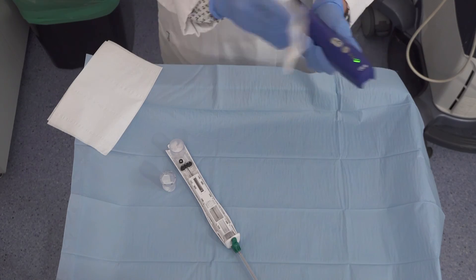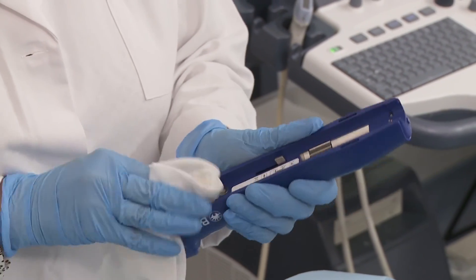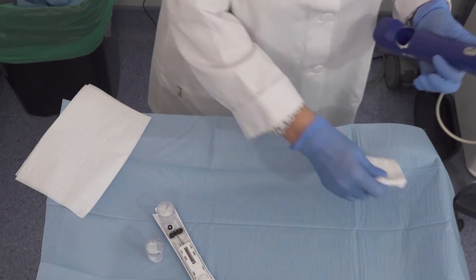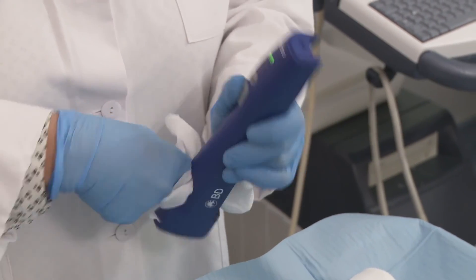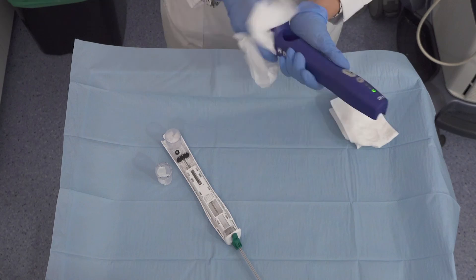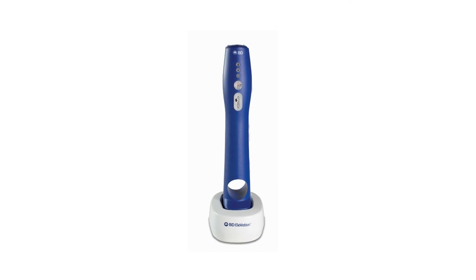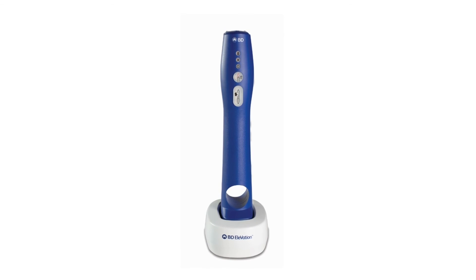After each use, wipe the BD Elevation driver with a validated product or cloth dampened with water to remove any excess blood or fluids present on the device. Pay particular attention to the buttons and indicators, locking tab, LED lights, internal gears, sample container slot, and sides of the driver. The driver must be dry before placing in the wireless charging stand. The probe, support cannula, sample container, and any other BD Elevation accessory are for single use only. After each use, the BD Elevation driver should remain in the charging stand, likewise when not in use.